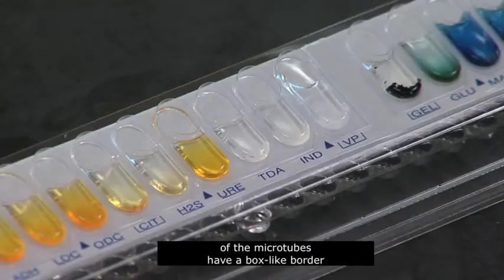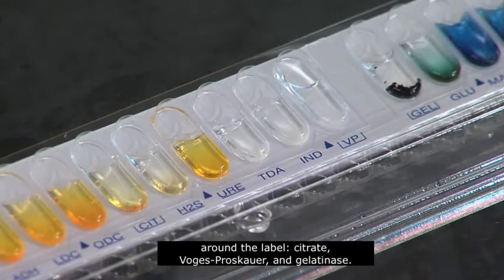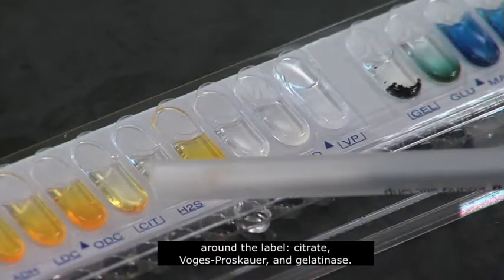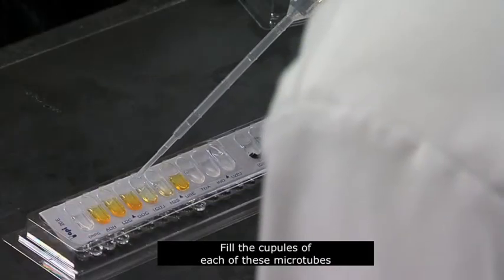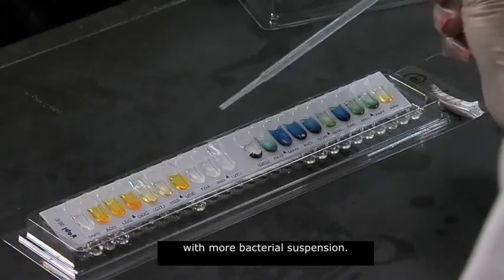Notice that three of the microtubes have a box-like border around the label: Citrate, Vogue-Proskauer, and Gelatinase. Fill the cupules of each of these microtubes with more bacterial suspension.